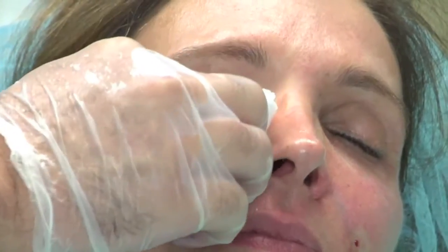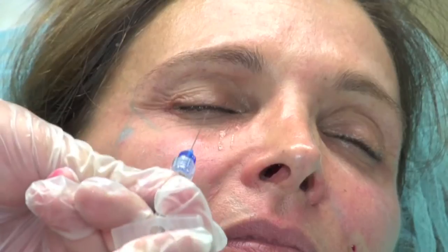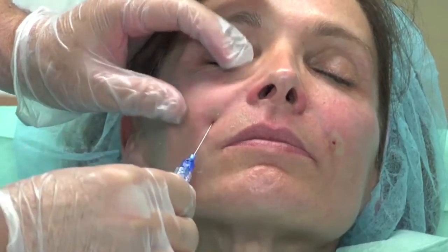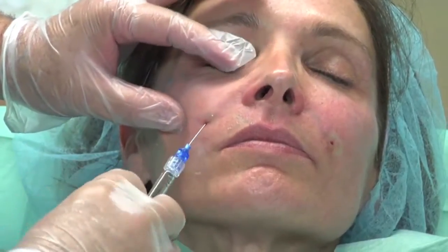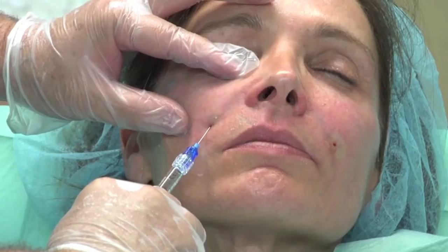Some standard techniques aim to just fill the holes or grooves. We encourage injections to be placed deep to the orbicularis with parallel vertical passes, forming a stalagmite shape. With a tunneling technique, the injector approaches the superior quadrant of the medial mid-facial viaduct.